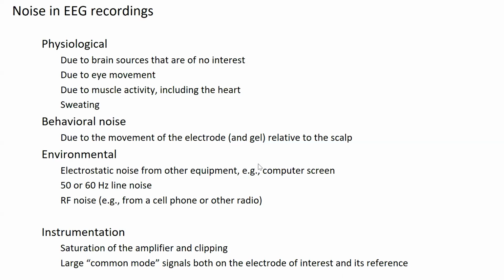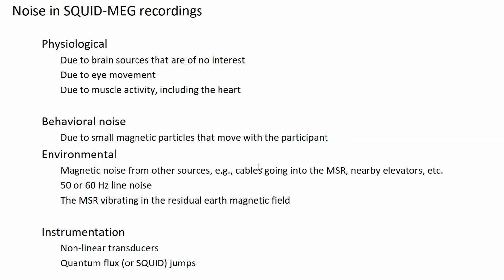There's also noise that is due to the instrumentation itself, so not necessarily due to the interface with the participant, but there can also be limitations in the hardware, such as the saturation of the amplifier and clipping of the signals, or large common mode signals between the electrode of interest and the reference electrodes, which, if the common mode rejection ratio is not so large, causes artifacts that are also visible.